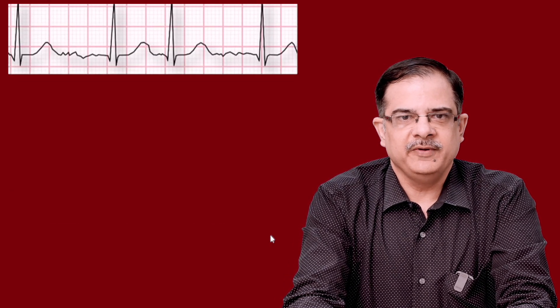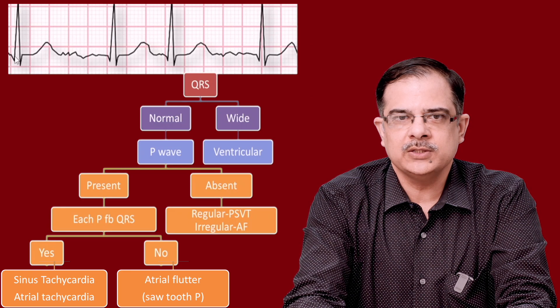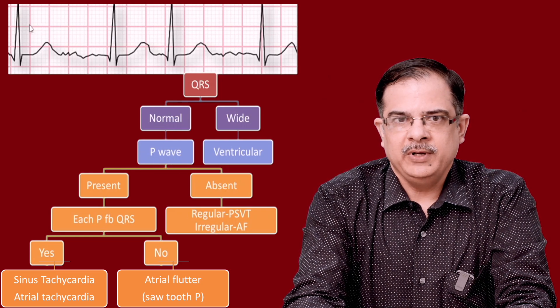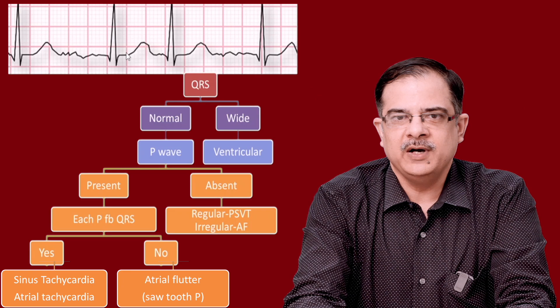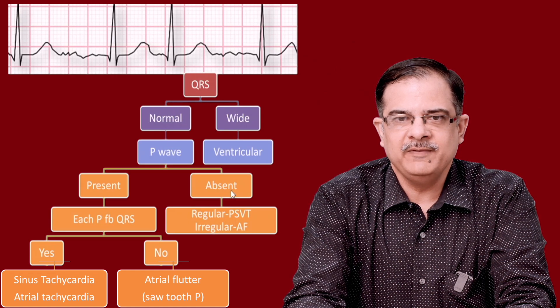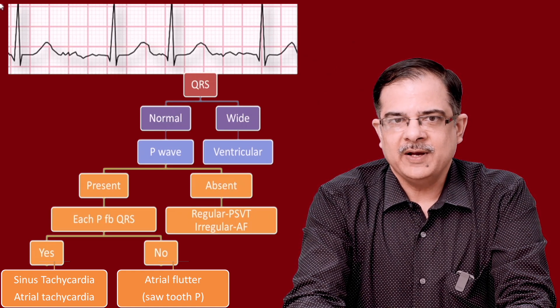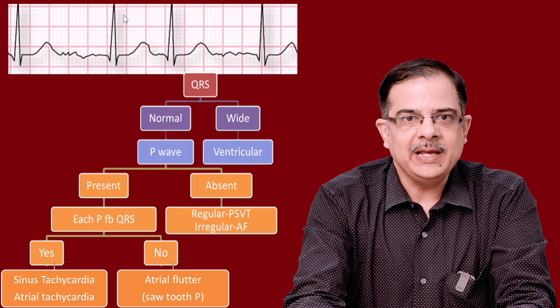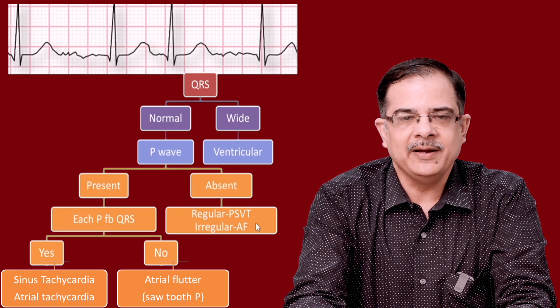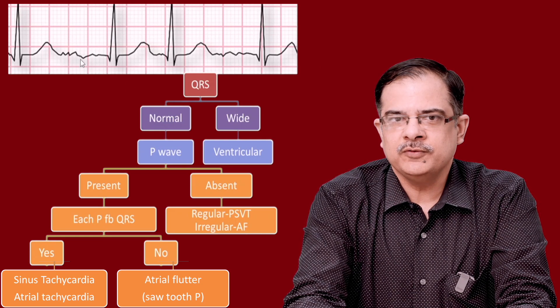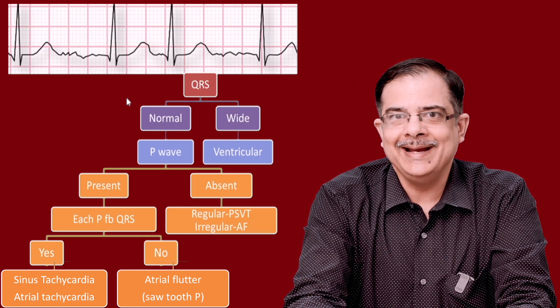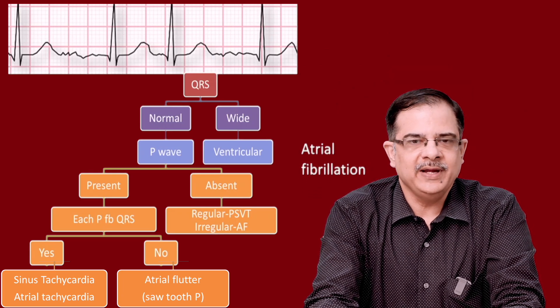Next ECG, applying the same flowchart: QRS complex is less than 3 mm — normal. Looking for P waves between two QRS complexes: only one definitive wave is present, which is a T wave — no definitive P wave is present, so P wave is absent. Looking at the RR interval: the RR intervals are varying, indicating irregular heart rate. Irregular heart rate with absent P waves means atrial fibrillation. You may also see small fluctuations in the baseline — fibrillatory f waves — but these are not mandatory for diagnosis.